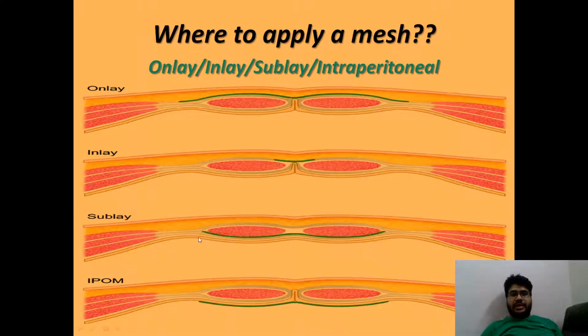What is sublay? Sublay is behind the rectus abdominis muscle but in front of the posterior rectus sheath. So this is the mesh and this is the posterior rectus sheath. It is applied in front of the posterior rectus sheath. This is the IPOM. What is IPOM? It is intraperitoneal onlay mesh plasty. So this is the peritoneum and we are putting the mesh in the intraperitoneal region. So on this surface we are having bowel. So here comes the importance of composite mesh, which we will be reading at the end of the lecture.